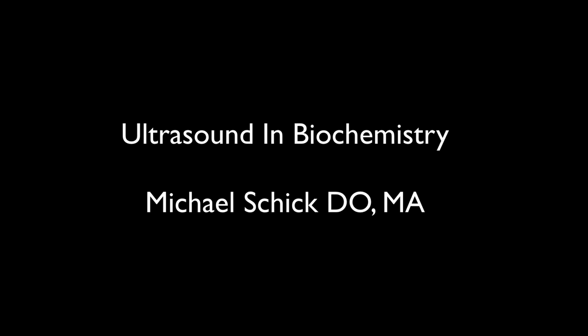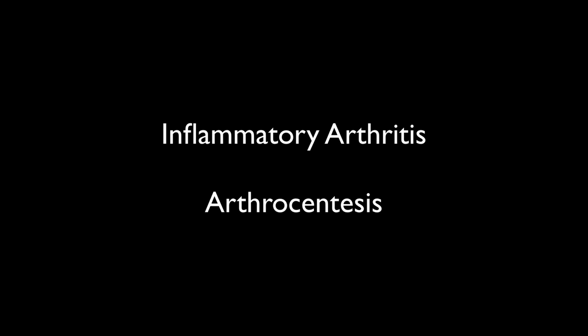I'm going to give you another example on how we can bring biochemistry to the bedside by using ultrasound. And in this example, we're going to be talking about ultrasound of a joint. And you can ultrasound a joint for many reasons. It could be fracture, inflammation, infection. But as a specific case, we're going to talk about gout.